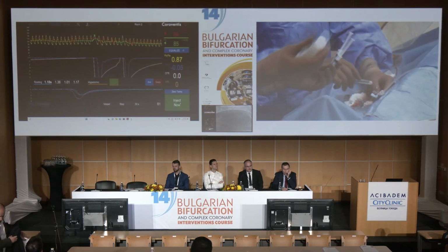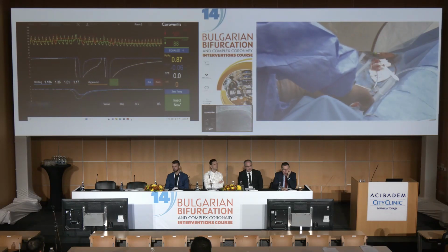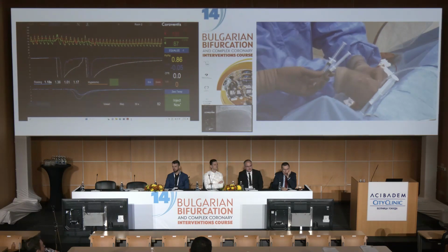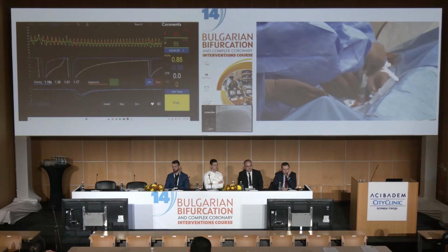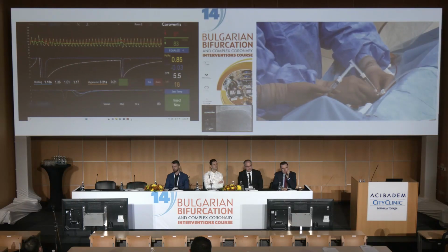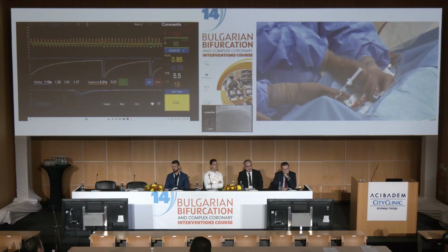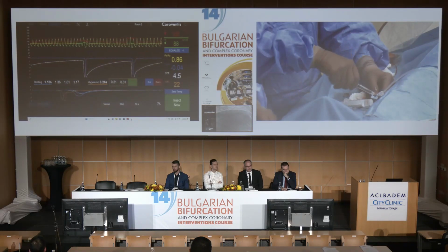And now we are going to wait for a stable signal. Yes, I think you can inject now. Go. And look at the morphology of the thermodilution tracings. You see the traces in blue. Inject again. You see these tracings? They are very fast, very narrow, completely different than what we have seen.